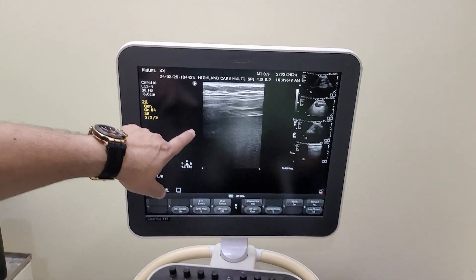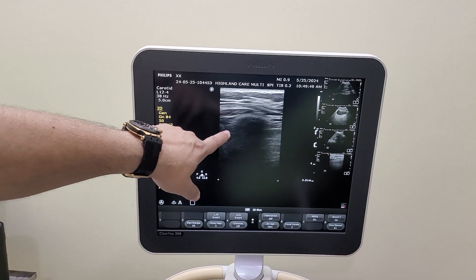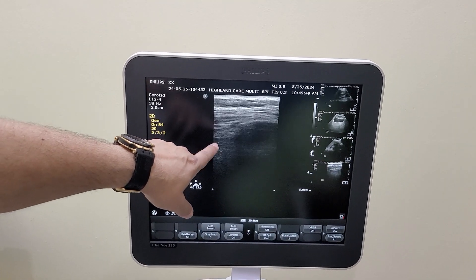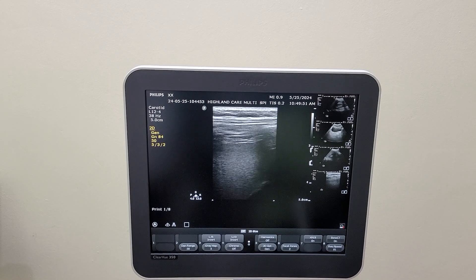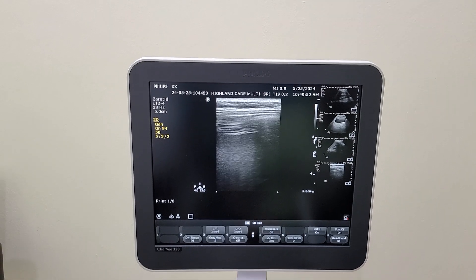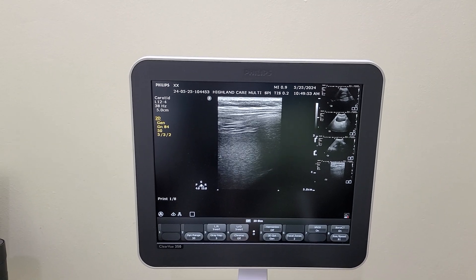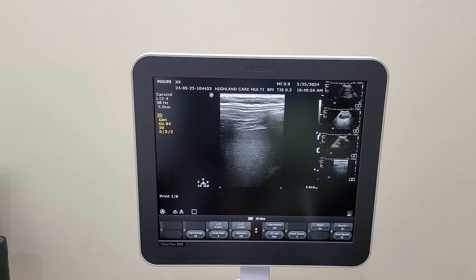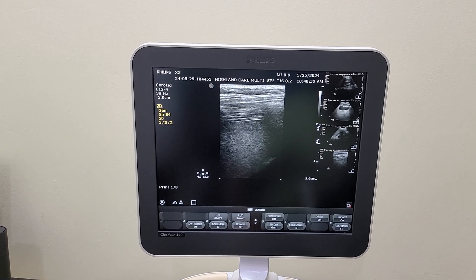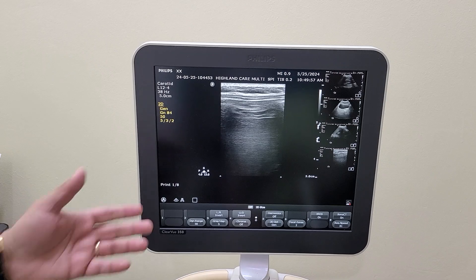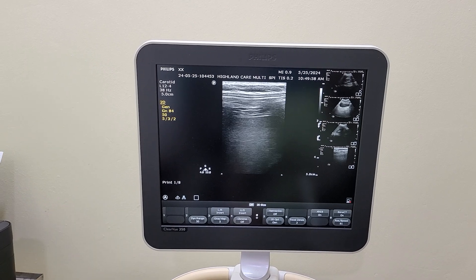This is on the left side — seemingly normal on the left-hand side also.